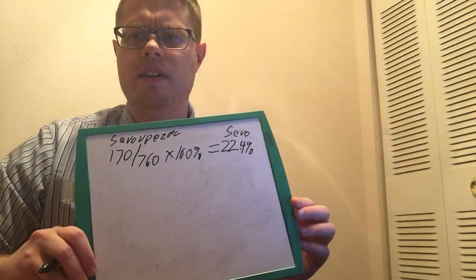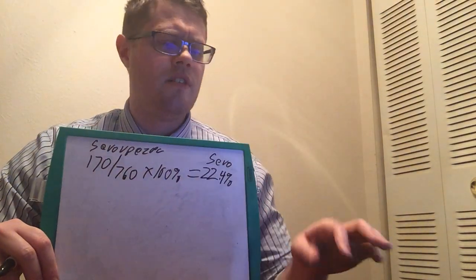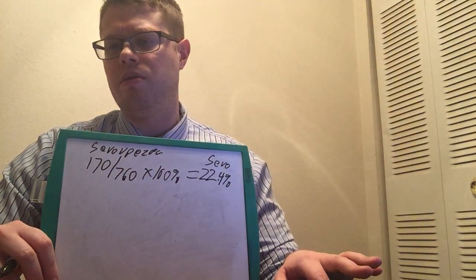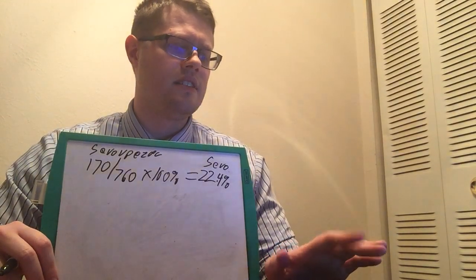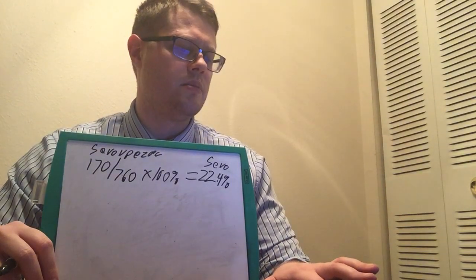That's why when we got the max delivery, Sevo could get 22%. Kind of great handwriting, that's why I make slides. If it was Iso, it'd be 238 divided by 760, which gives 31%, so that's how we get all those numbers from earlier in the slide.